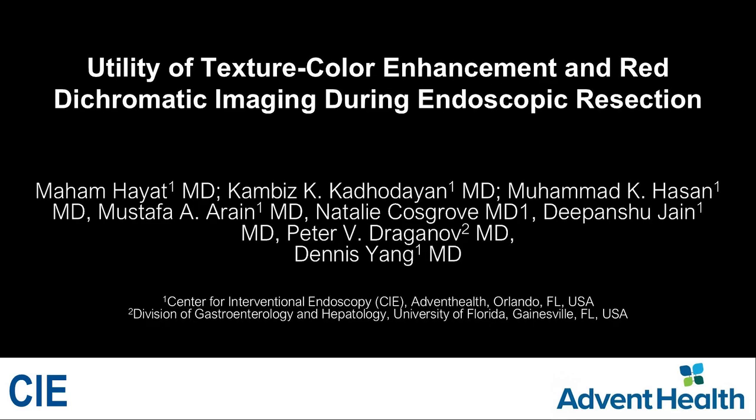Utility of texture color enhancement and red dichromatic imaging during endoscopic resection.